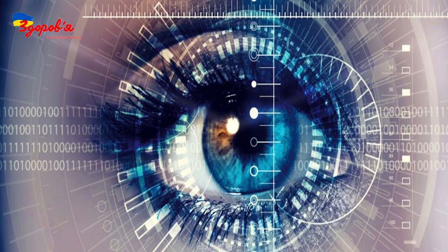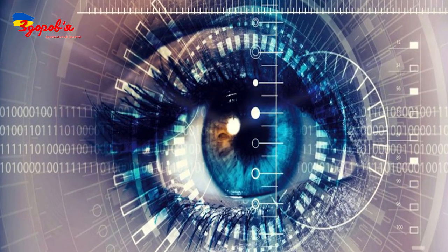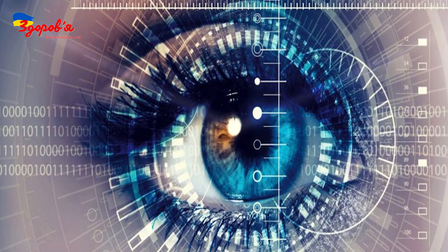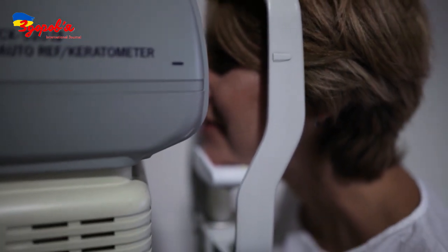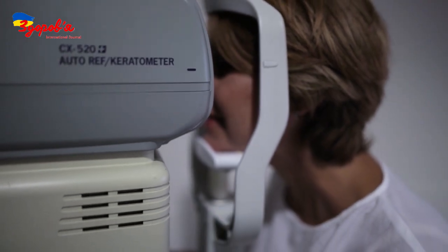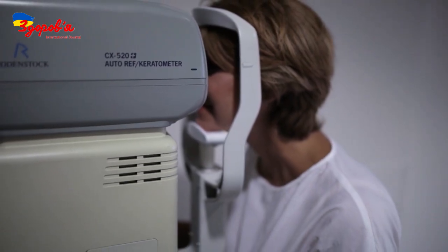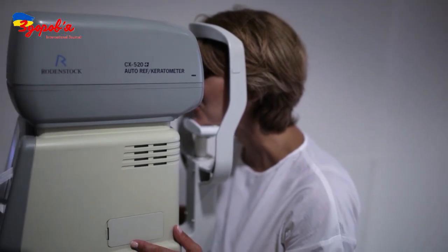Phacovitrectomy is indicated in the presence of detachment of the retina, macular tear, hemophthalmos, proliferative diabetic retinopathy, etc. At the first stage, a thorough examination is carried out using modern diagnostic equipment. As part of diagnostics, visual acuity is checked, ultrasound examination is performed, and intraocular pressure is measured. Examine the fundus, perform optical coherence tomography, if necessary with angiography, depending on the presence of vitreoretinal disease and concomitant diseases. The patient goes for additional tests, as well as for consultation with narrow specialists.